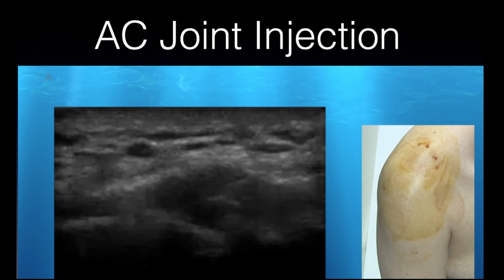So if you get an x-ray and everything looks normal, I would still scan them and look for that calcium deposit. Now, if they're in that much pain and you don't see any calcium on ultrasound, I would probably at least do a subdeltoid cortisone injection. You may want to add some lidocaine for diagnostic purposes. I forgot to mention, for the calcific deposit, I do go in with lidocaine first, because I want to numb that whole tendon up, because it is painful to distend the tendon.